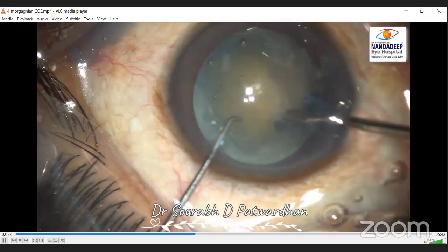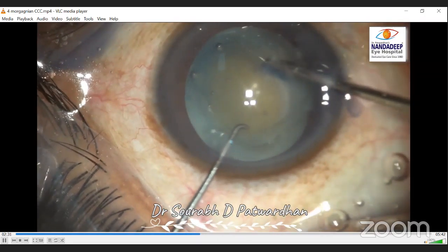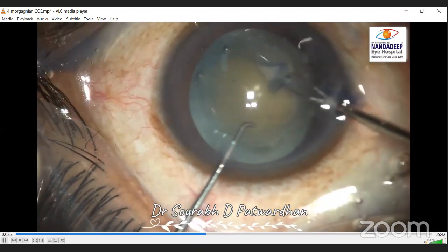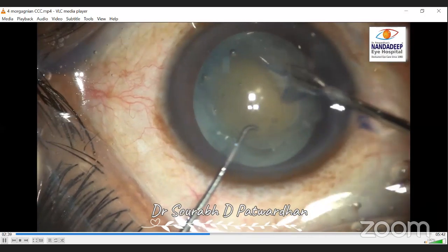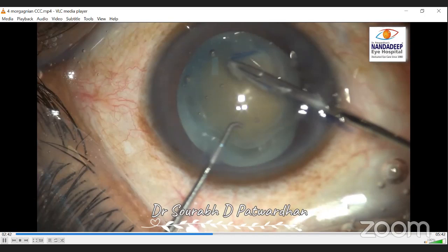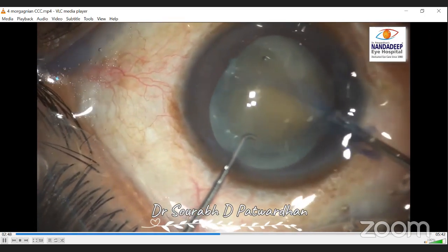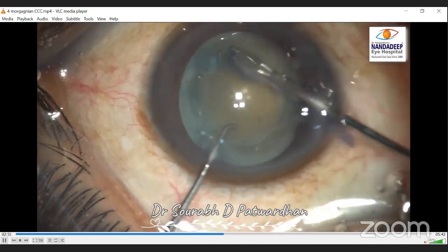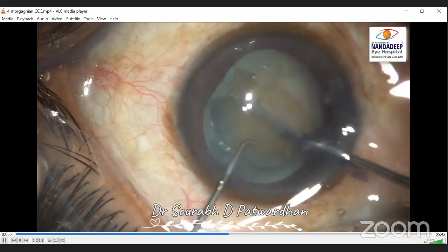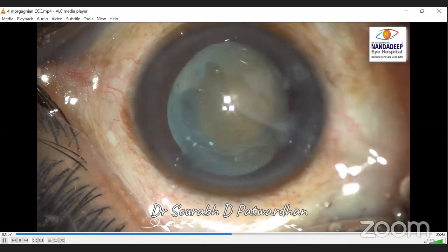So again, I go in with capsulorhexis. And again, tangential. Now watch here, what I do. I suddenly become a little bit lazy here, and instead of giving tangential force, I start tearing. See what happens? The rhexis goes out because the zonules are getting pulled in. So luckily here, I could retrieve the rhexis, but this is not a good idea to do in Morgagnian cataract.